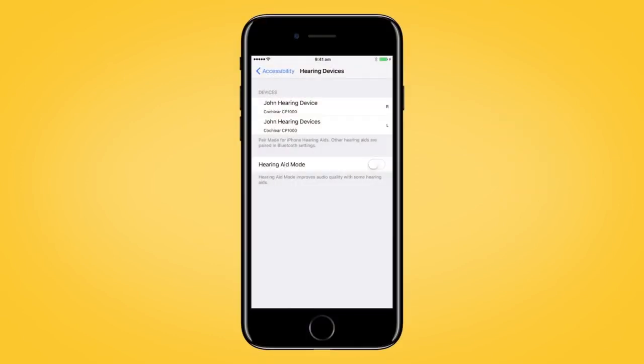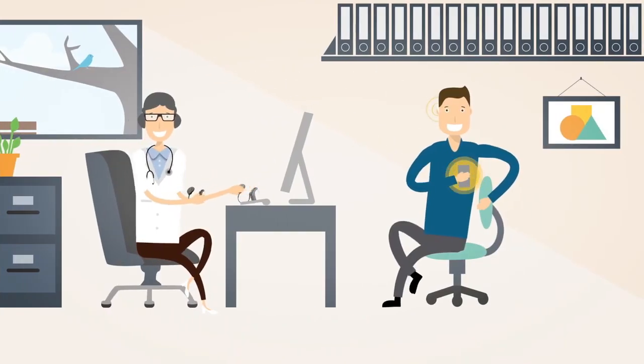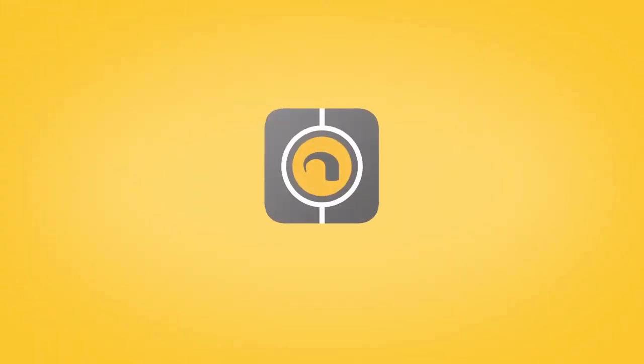If you see your sound processors listed as two separate devices in the Devices section, see your clinician to have them configured as a pair. If you have not done so already, download the Nucleus Smart App from the Apple App Store.